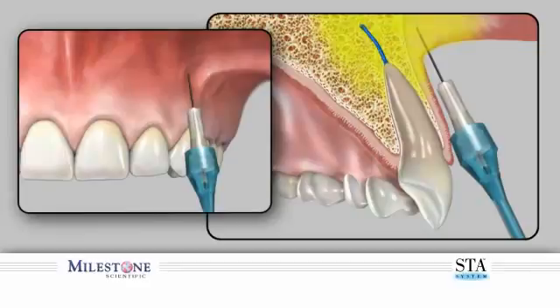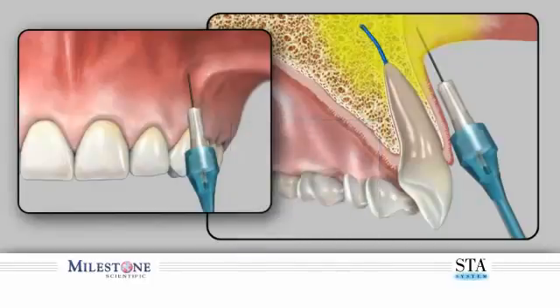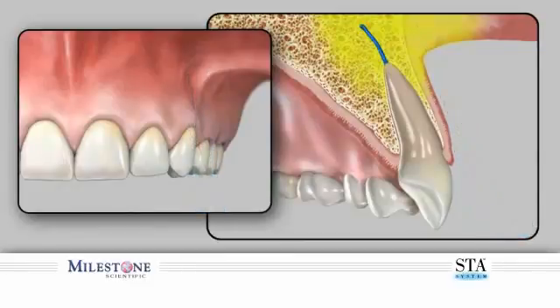To avoid anesthetic solution sprayback into the patient's mouth, perform the following. While the needle is still embedded in patient tissues, depress and release the foot control pedal. Count 3 beeps after releasing the foot control and then remove the needle from within the patient's mouth. Direct the needle away from the patient as a small amount of anesthetic solution may still be present. Should you require more than one anesthetic cartridge, you can reload subsequent cartridges and continue as required. Please see the section on multi-cartridge technique.